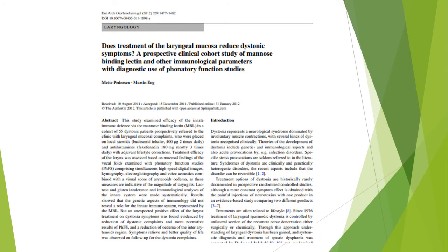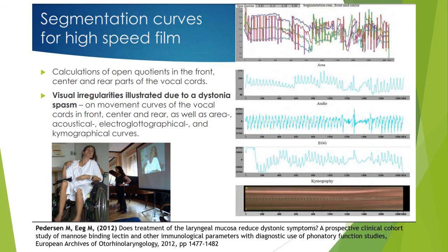Electroglottography has some interest to define genetic aspects of voice pathology as well as medical disorders before and after pharmacological treatment, as in this example. Dystonia has been hard to document objectively because the changes come and go, but here you see the electroglottography of a dystonic patient, which certainly is impressive, with two different kinds of abnormality of the electroglottographic curves.